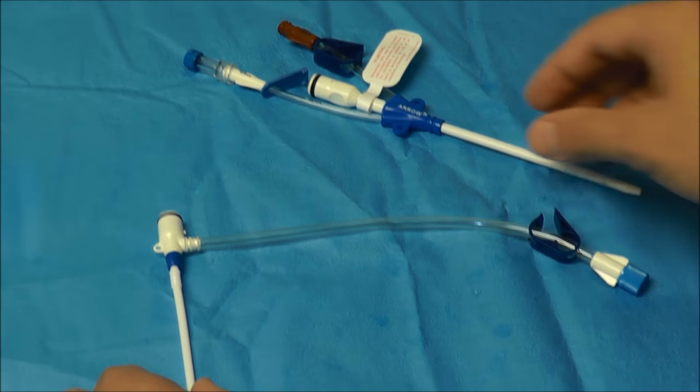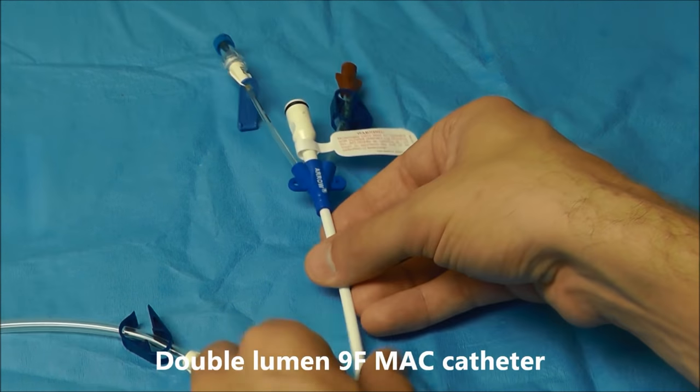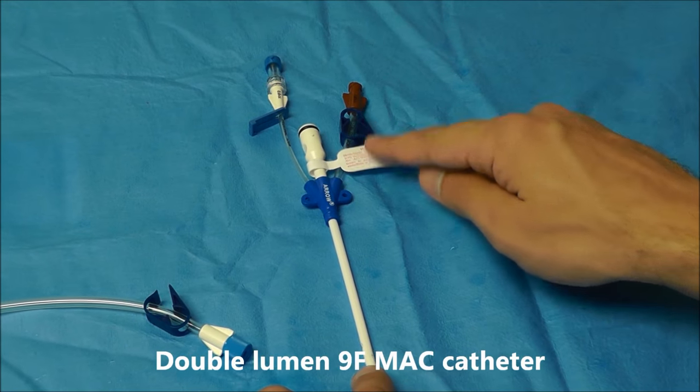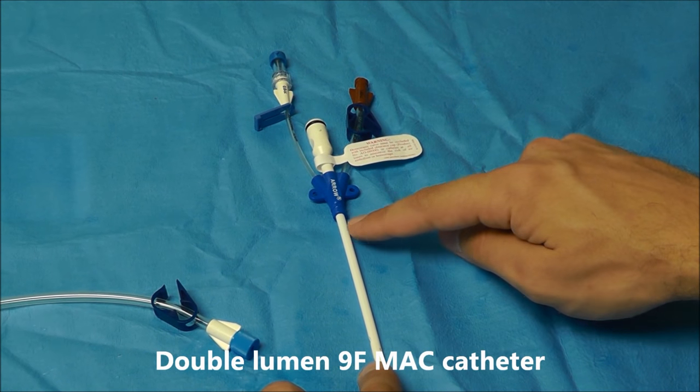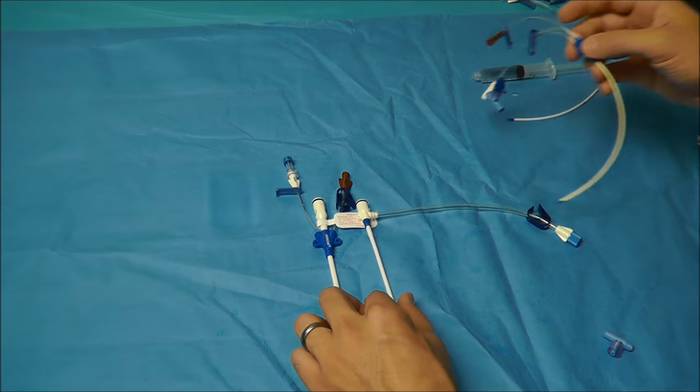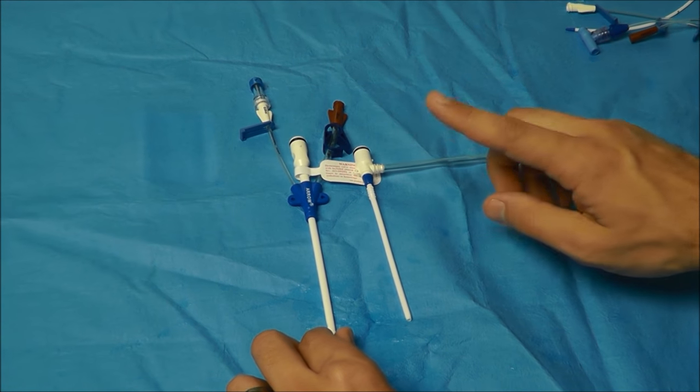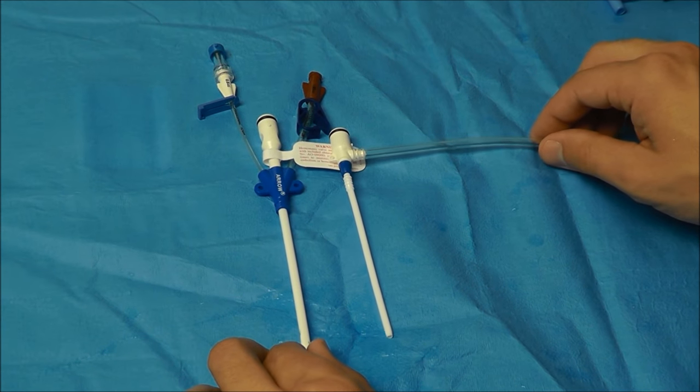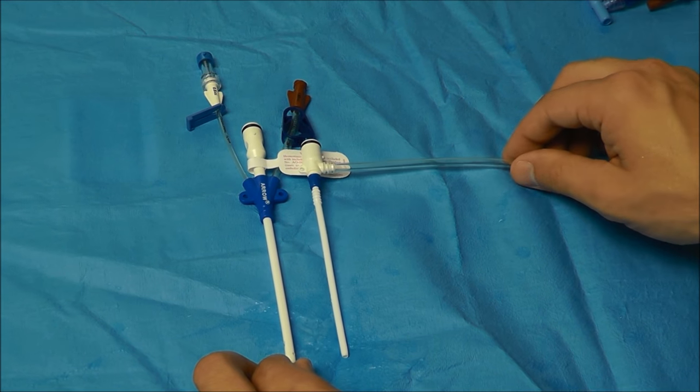It has one lumen here, and the other example is the 9 French double lumen MAC catheter. The advantages to these catheters is number one, you get faster fluid infusion because they have a larger diameter lumen.